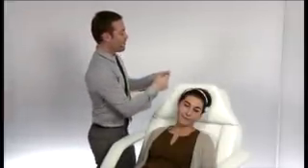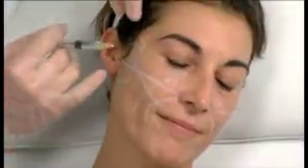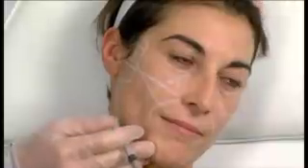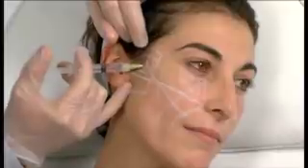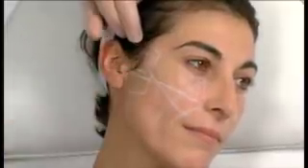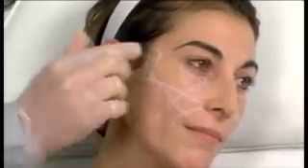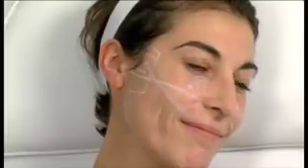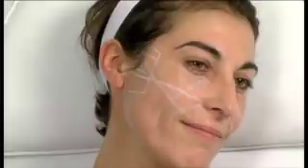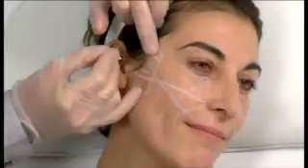Okay, thank you. So to begin with, it is not very necessary, but I like to give my patients as least discomfort as possible. I would like to start off with giving her a little bit of local anesthetic onto the tip of the zygoma. And this local anesthetic is with adrenaline, and actually this adrenaline is the key, because even though we're going to use a cannula, we have to use a normal needle to puncture the skin.